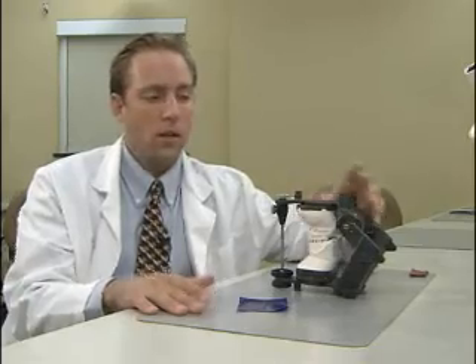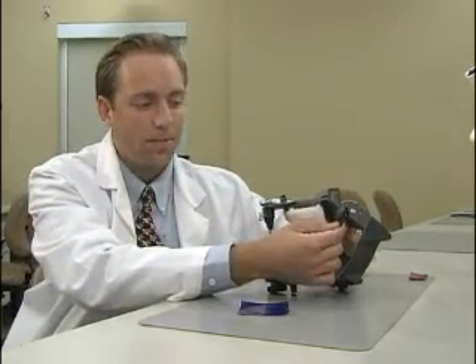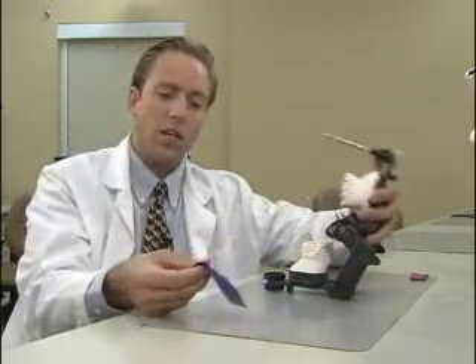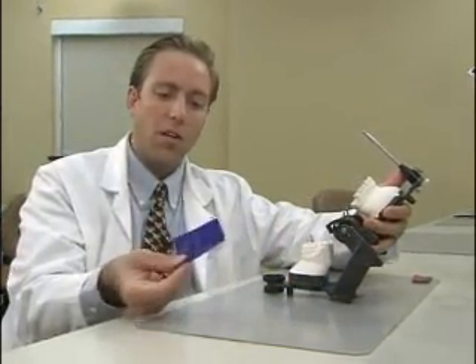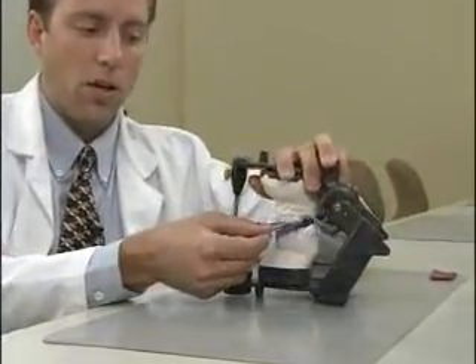Let's go ahead and set up the articulator. The first thing we're going to do is verify our first point of contact in centric relation. Make sure your centric latches are locked before proceeding. Open the articulator, place some articulating film between the two arches, and occlude the arches.